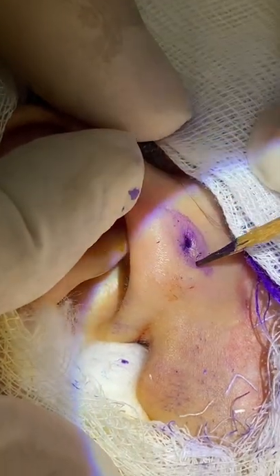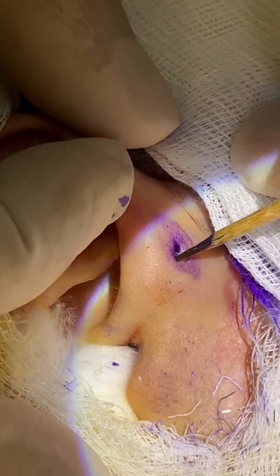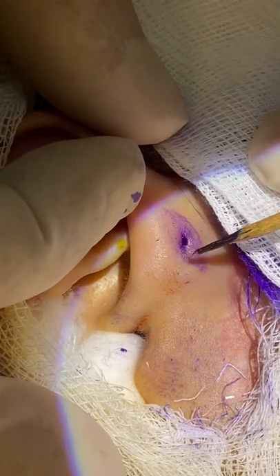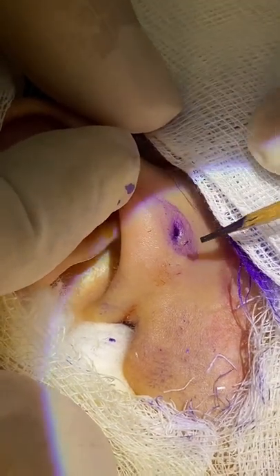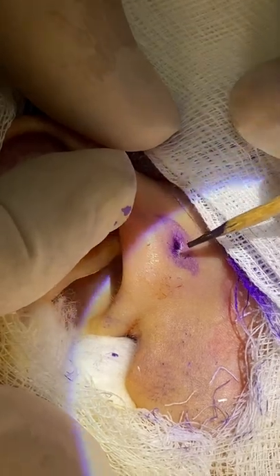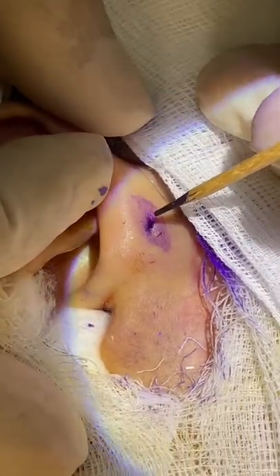Now, first it will be sharp dissection using a sharp instrument — I am using blade 15. Then after that I will be doing some blunt dissection to remove the sinus itself, going down the tube, the sinus tract.